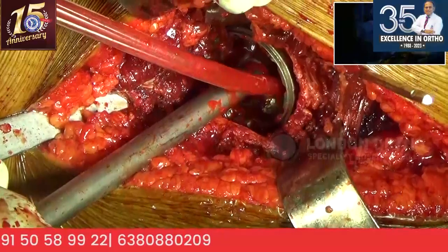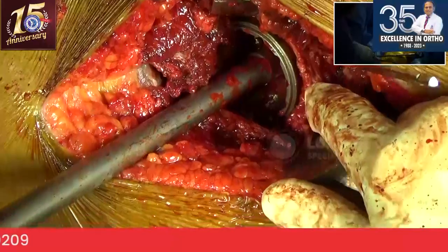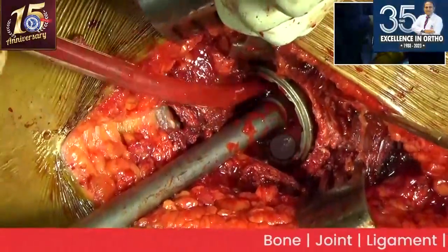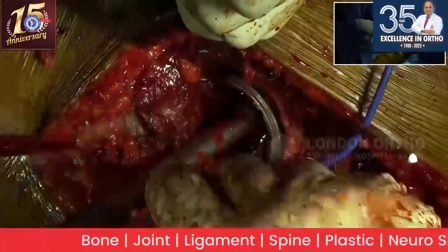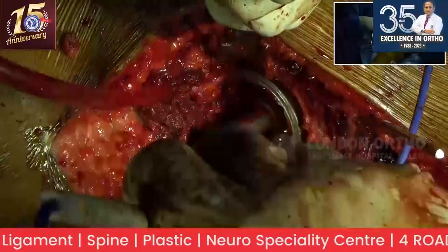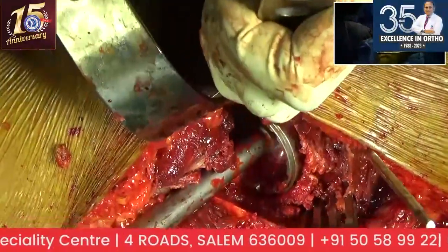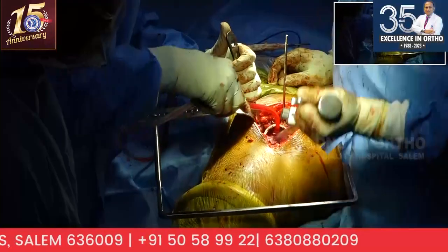Okay, so it's holding better. Okay, I'm happy with the 48. Still, it's not perfect, but this is as much as I can get. I don't want to put a bigger cup. It already looks slightly bigger than the inside. Wobbles a bit. Okay.